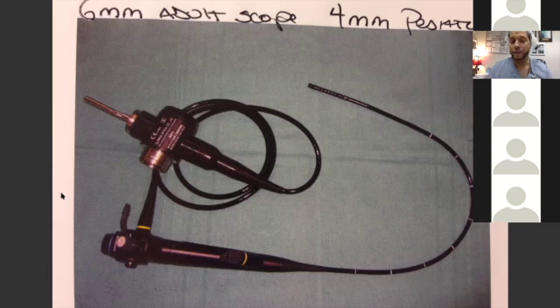So when you can, say, hey, we have this difficult airway. Can we use the adult fiber optic scope? And you may have to call endoscopy to bring it up because we don't have it in the main OR. But listen, you're the physician. You have a patient with a need. If you feel it's appropriate to use the adult scope, you demand it. You say, listen, because the surgical techs and the team that gets the room ready, they have the ability to get whatever equipment they need. So you say, listen, we need the adult fiber optic scope for this case, and that's it.